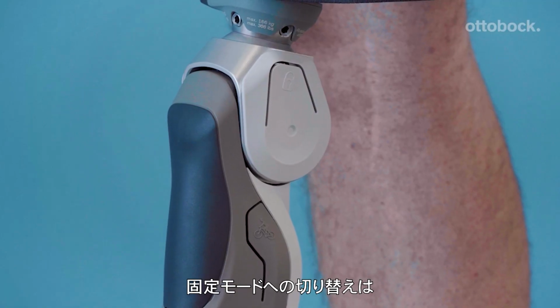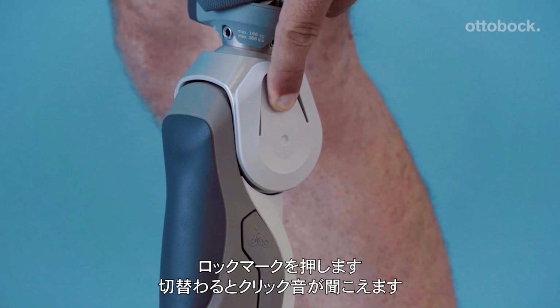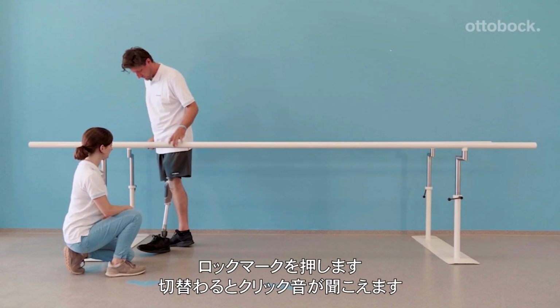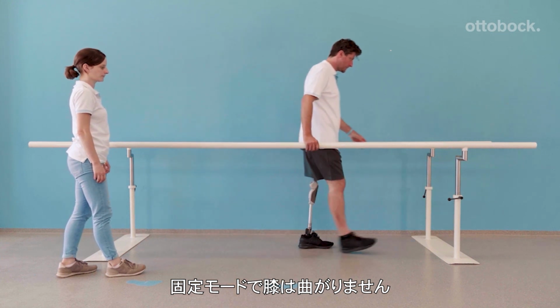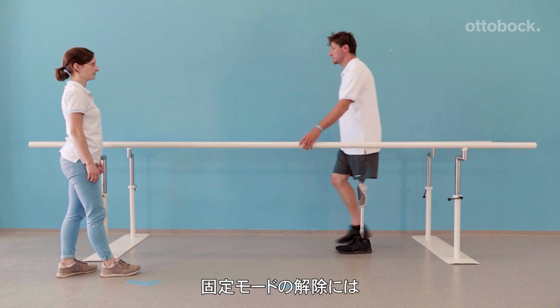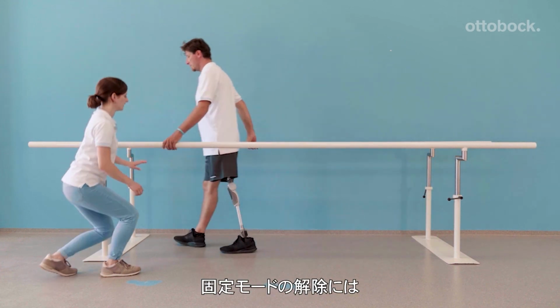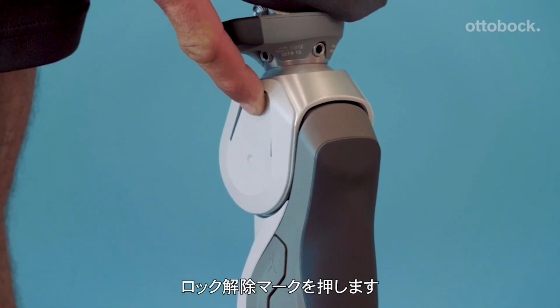To activate the lock mode, have the knee extended, push the lock button, and listen for the click. Use carefully. The knee is locked. Stance release cannot be initiated. To disengage the lock, push the unlock button. Carefully verify that the knee is unlocked.